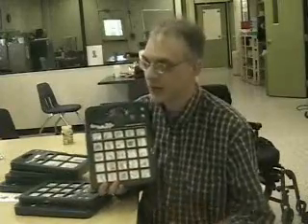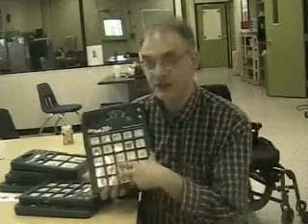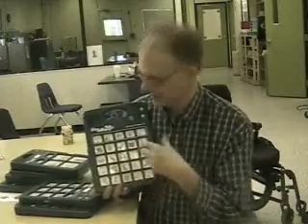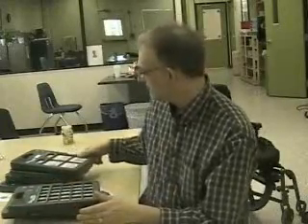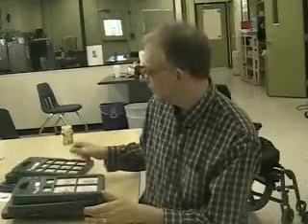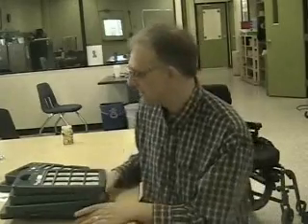If I'm going to study different kinds of plants, I could put the different parts of the plant on here and different kinds of plants and that kind of thing. So the potential of this device is kind of limitless, and we use them a lot. Of course, my students aren't here, and I'm not using them right now in their rec leisure activity.